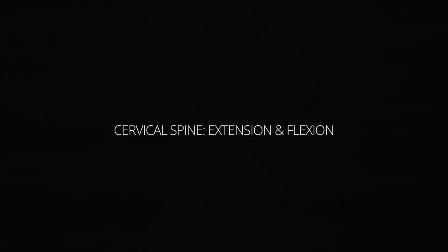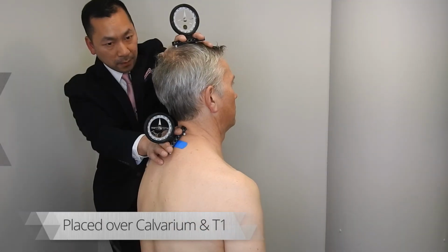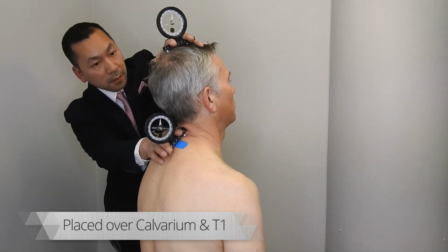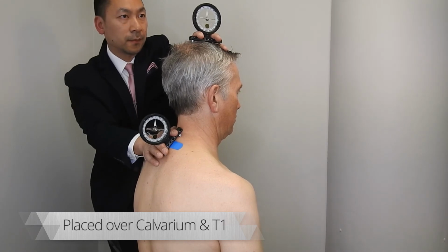Cervical spine extension and flexion. Subtract the T1 measurement from the calvarium for the range of motion.